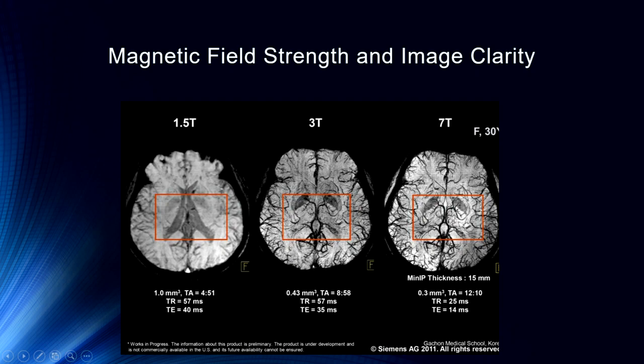These are only in research centers. It's going to be an expensive unit. It's also, we're starting to breach some levels of safety in terms of the level of the magnetic field. One of the things you have to keep in mind with a magnetic resonance imaging unit is you have to shield the unit so as to protect everything on the outside. Because it's such a strong magnetic field, lots of metal will come flying towards the magnet, which is why you have to take everything off.